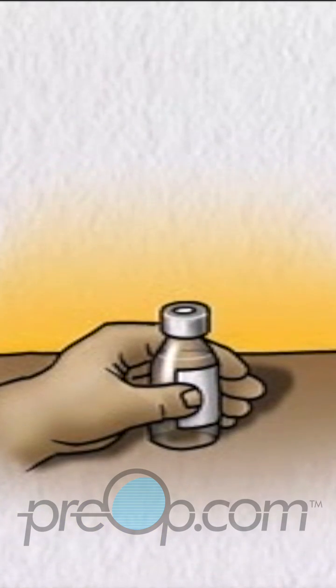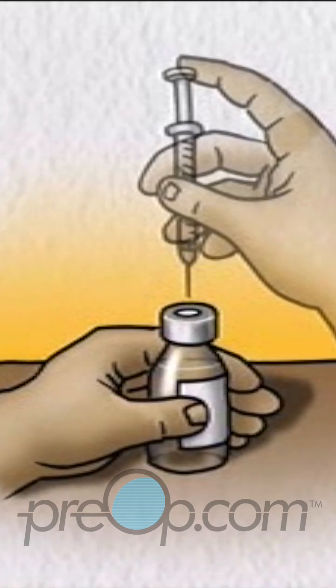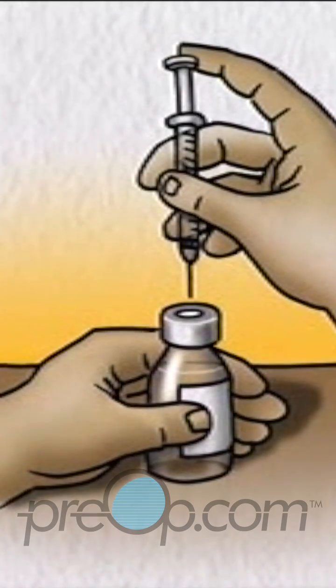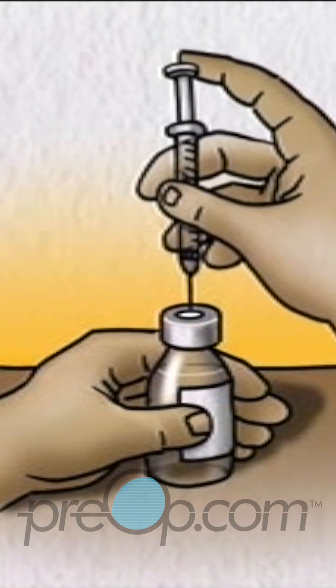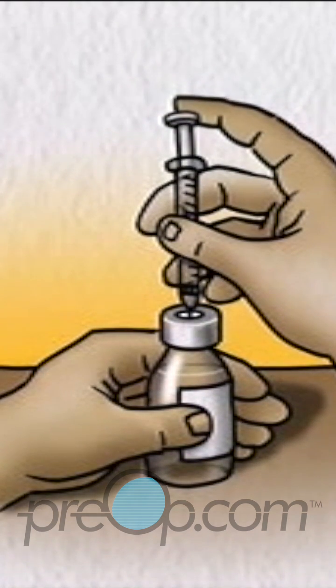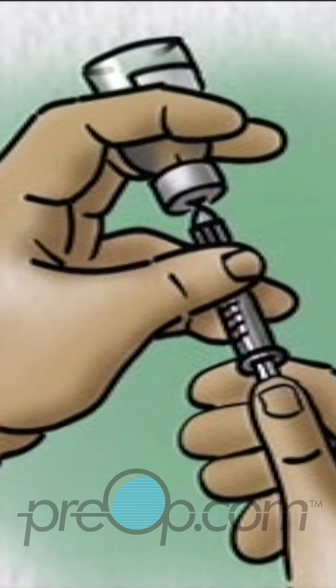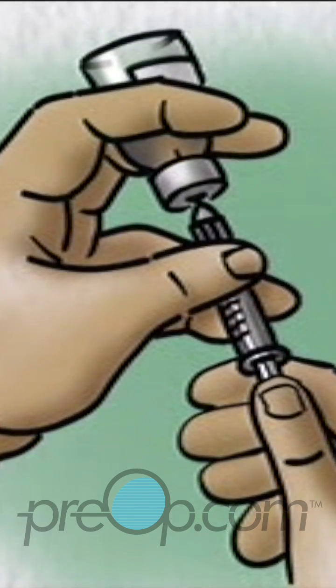Check the insulin bottle to ensure you have the correct clear type of insulin. With the insulin bottle held firmly on a counter or tabletop, insert the needle through the rubber cap into the bottle. Push the plunger down so that the air goes into the bottle, then turn the bottle upside down so that the air in it goes to the top.